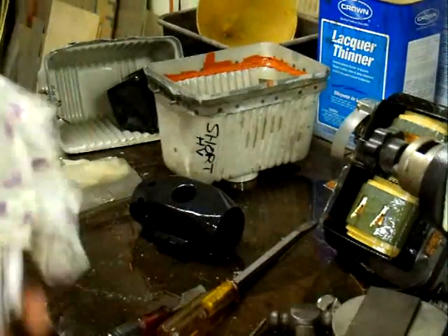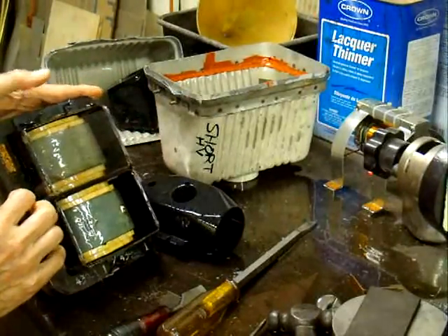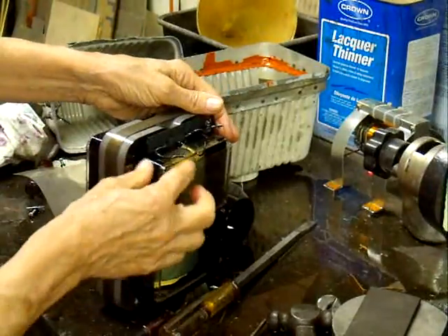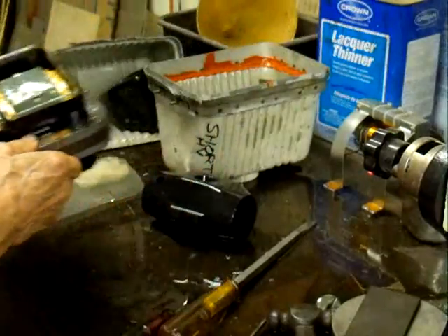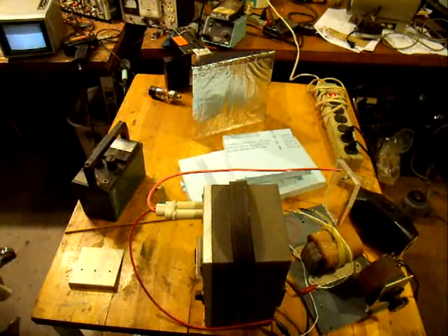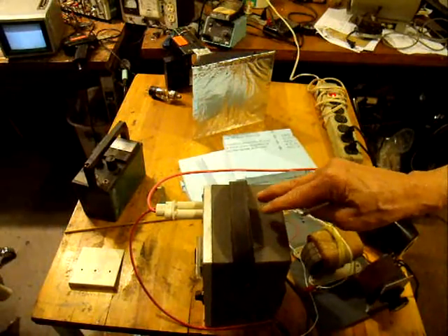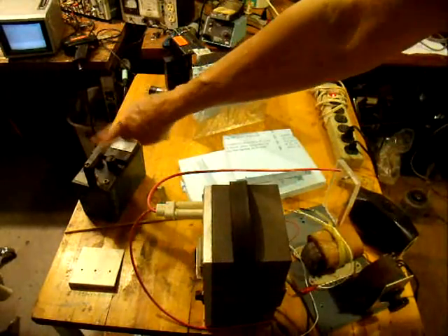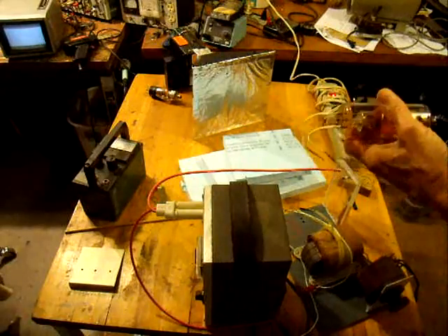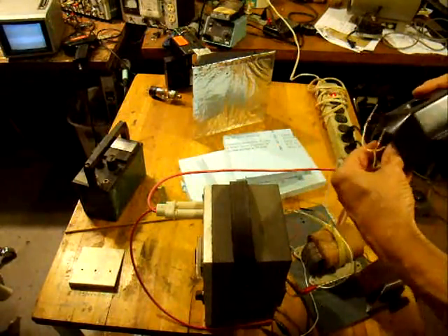That's how we open up one of these Gendex X-ray heads. Now let's see if we can find the short — I don't see any sign of arcing, so the only way is to hook power onto it and see where the short circuit is. There doesn't seem to be anything wrong with it, which means we probably have a good transformer. We'll go ahead and test the X-ray tube now. Our setup has a filament transformer with a variac hooked onto it and a high voltage power supply that goes from 10 kilovolts to 40 kilovolts. We've got a survey meter to make sure we don't get radiated.